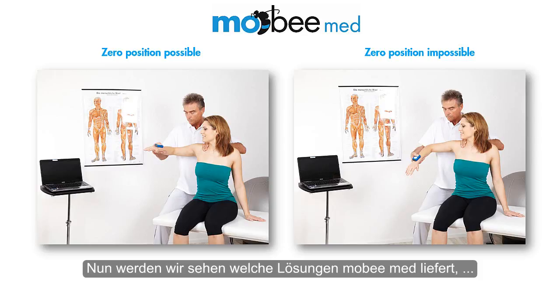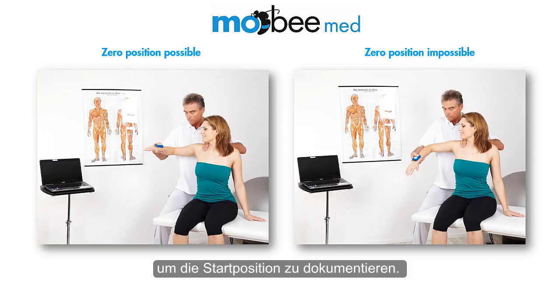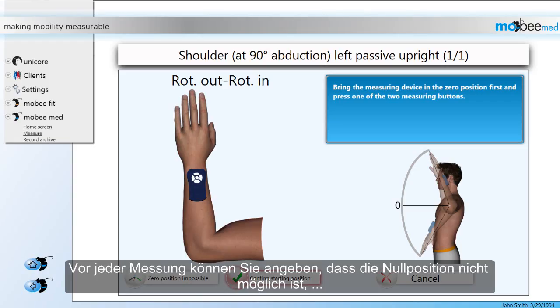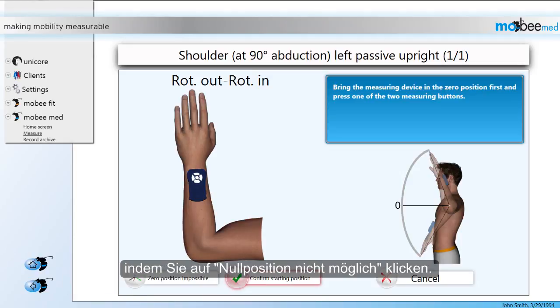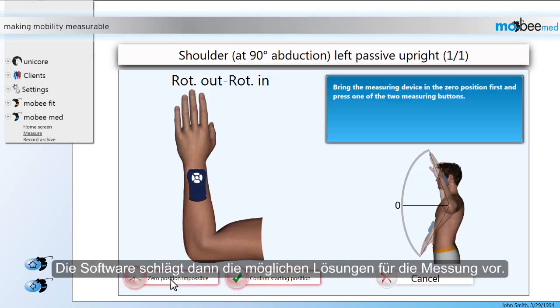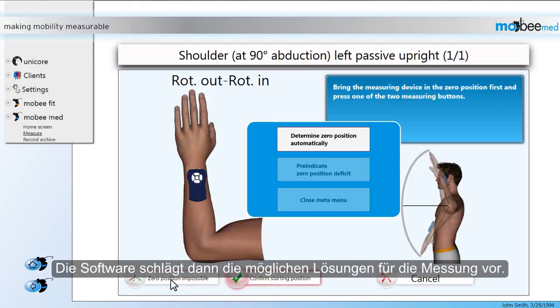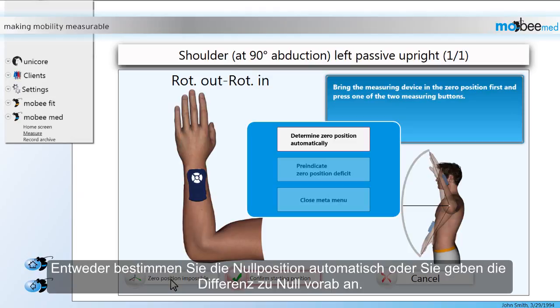Now we are going to take a look at which solutions MobiMid provides in order to document a starting position. Before every measurement you have the option to indicate that the zero position is impossible by clicking on the button 'Zero Position Impossible'. Then the software offers the solutions available for the current measurement. You can either determine the zero position automatically or pre-indicate the zero position deficit.